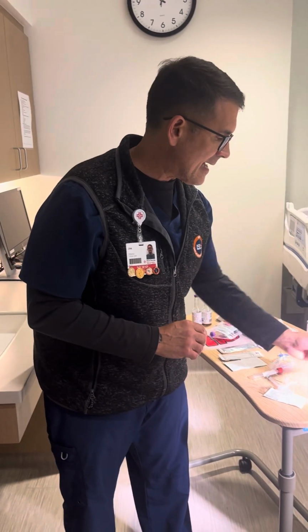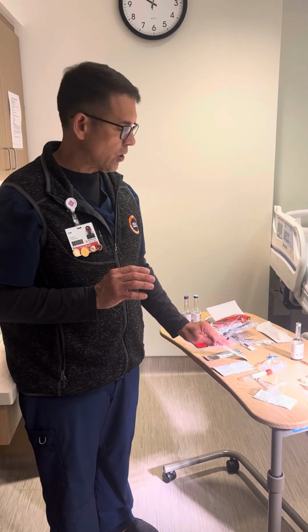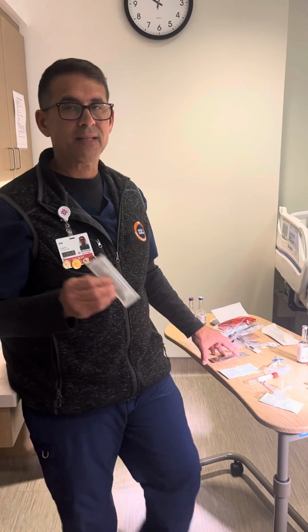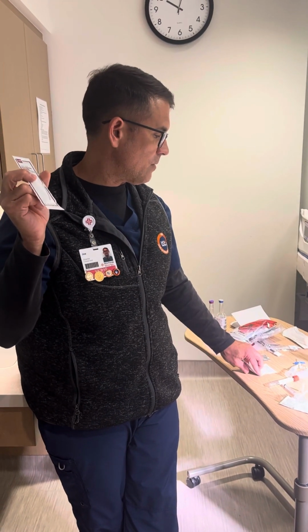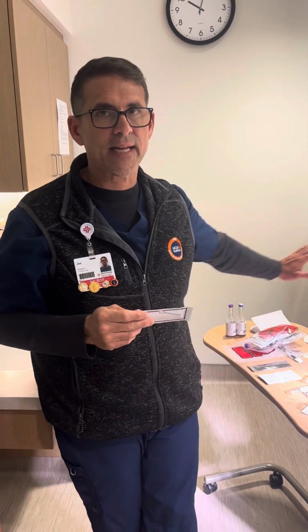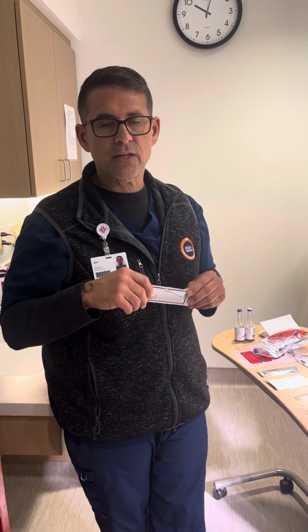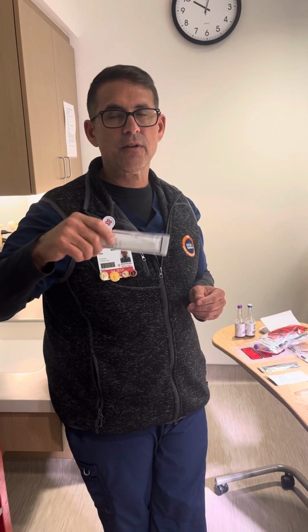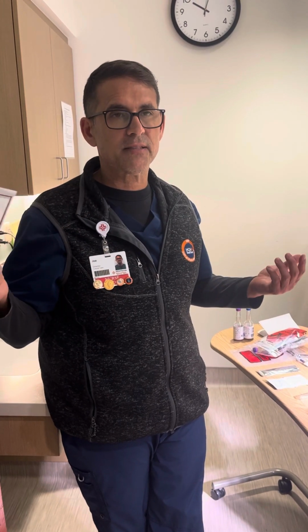So for pediatric blood cultures, anybody younger than 2 months old cannot have chlorhexidine. They have to have iodine. What I always like to do is, when I'm prepping the site, I make sure that everything else is ready, so that after I prep the site, I don't have to be getting more stuff, right? With iodine, you're going to scrub back and forth for 25 seconds. Some people say 30 is fine. 25 seconds is what our policy shows. That's best practice, but if you want to do 30, that's fine.